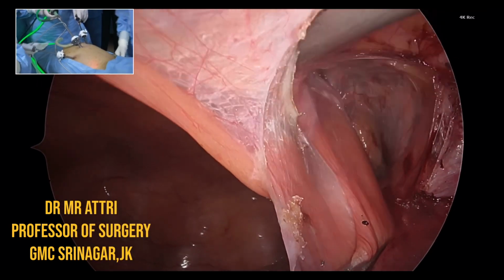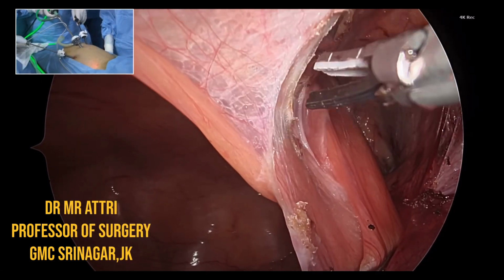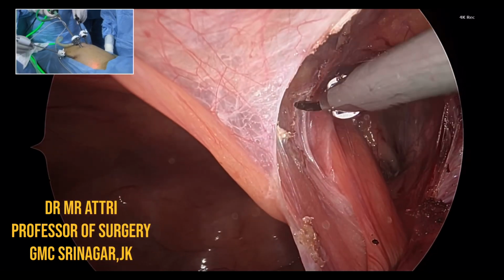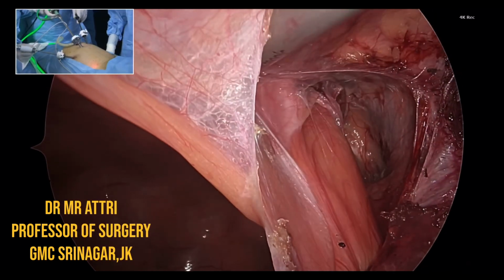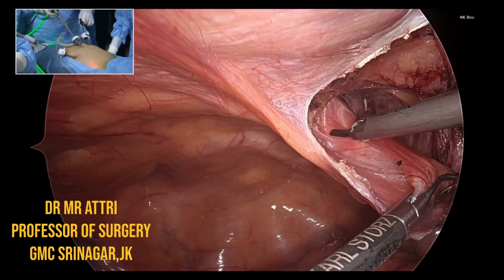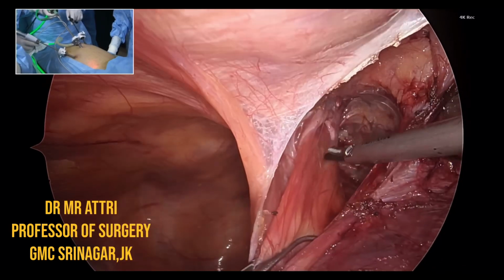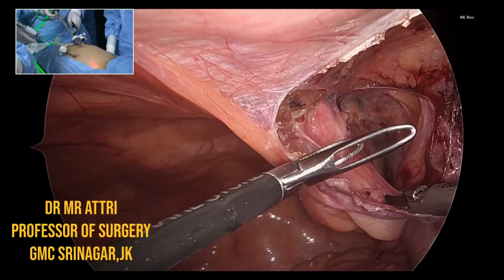So the job that I've been given today is to operate on this 70-year-old lady. About a year back, in a district hospital, she underwent a laparoscopic gallbladder surgery. And then from the lateral port, she had a bleeding. She was explored for the bleeding and the hemostasis was secured. Now from that same lateral port, she then developed an incisional hernia. The incisional hernia was repaired using an onlay mesh.